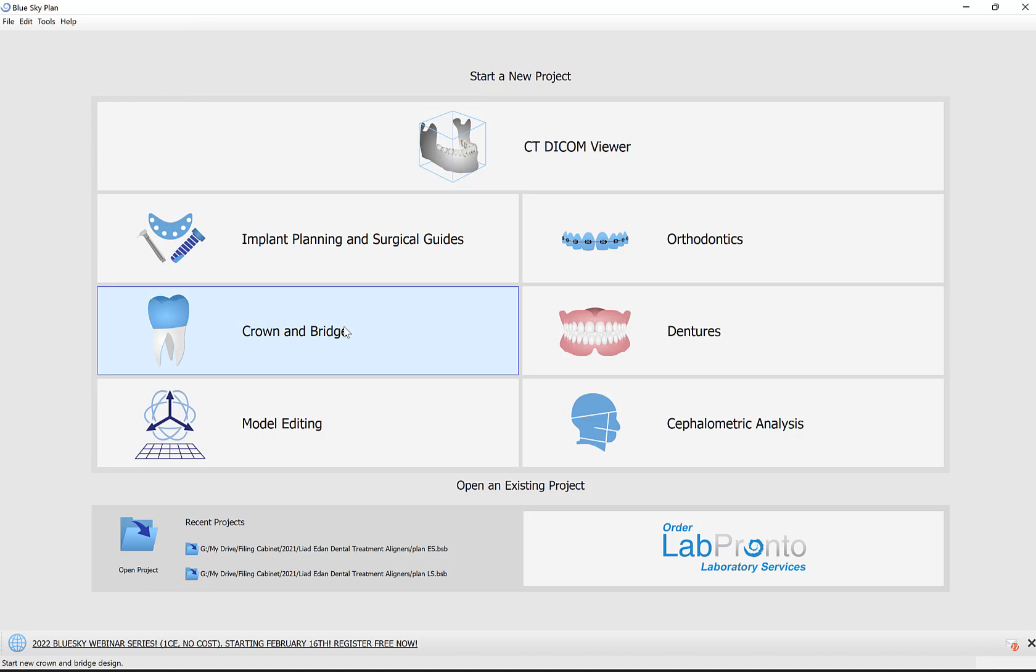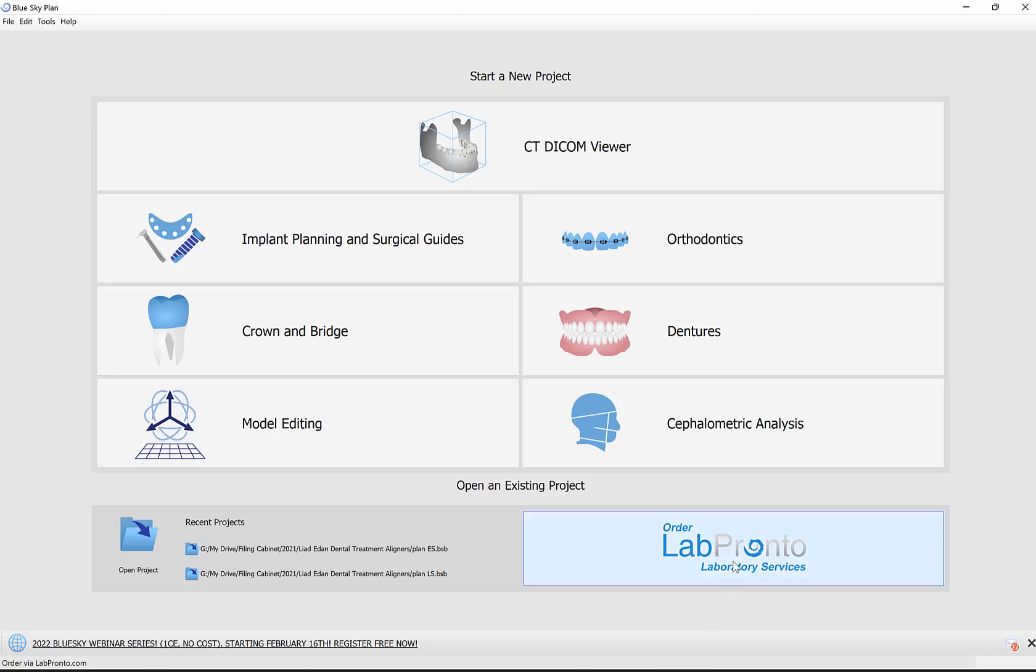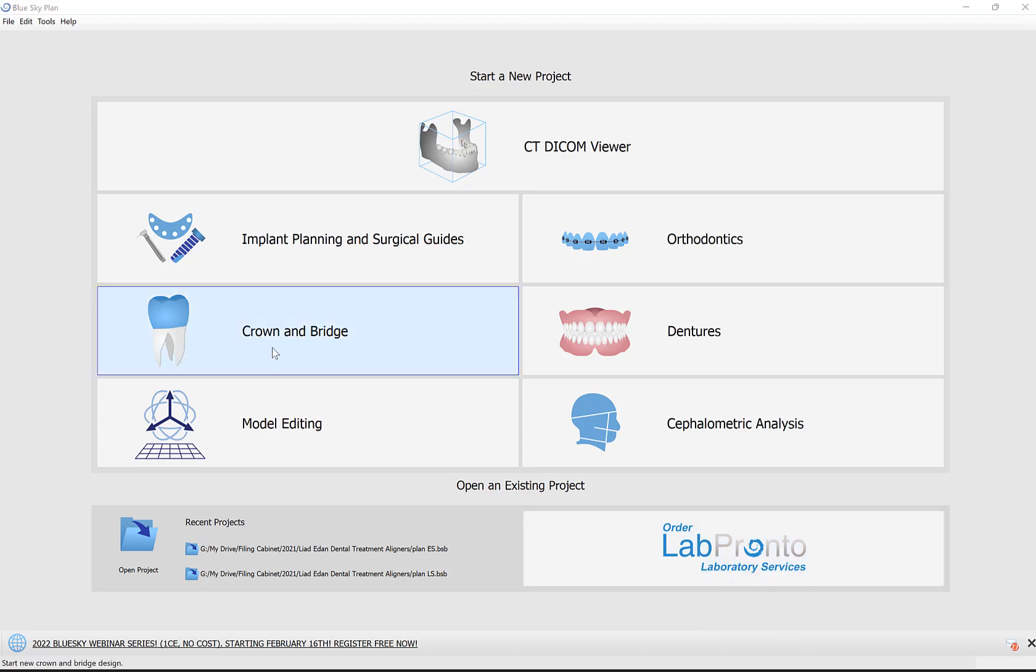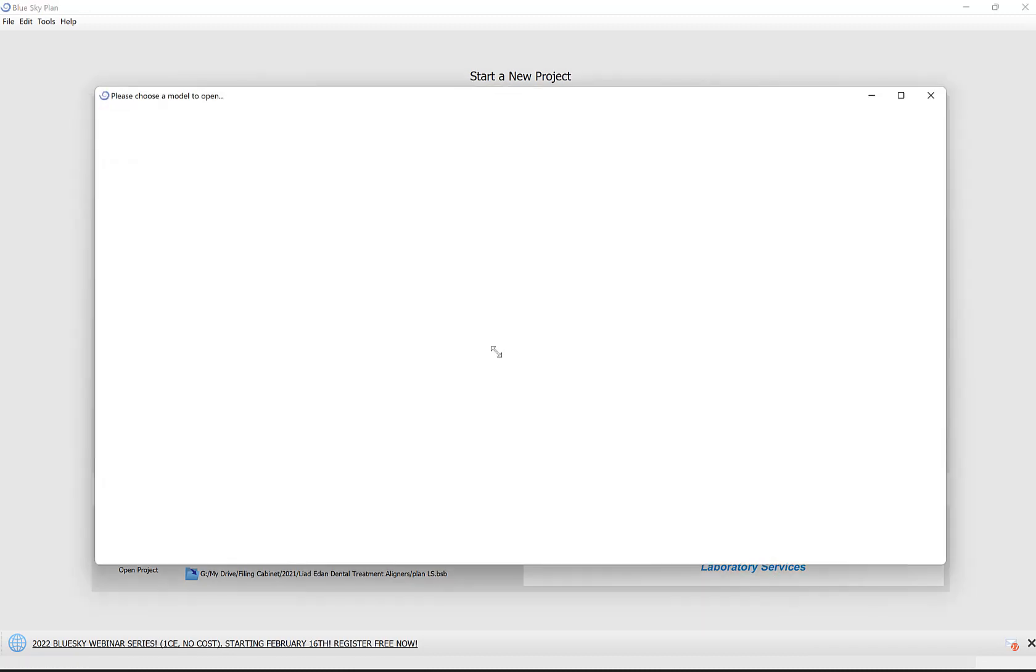A couple of comments before we get started. Exports from the Crown & Bridge module are completely free—both the STL file and the XML configuration file. If you like assistance with design or manufacturing, click on the Lab Pronto option and place your order there. I'm going to click on Crown & Bridge, select Crown for Titanium Base.